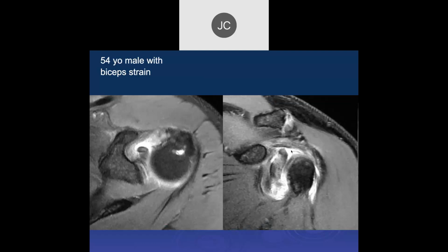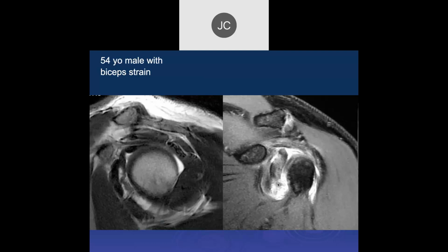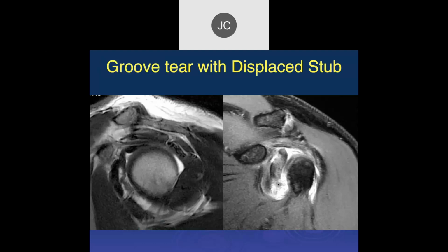That's the biceps tendon retracted down into the joint space. So this was even a bigger loose body. This is all the proximal stump of the biceps, and it can produce a major mass effect within the joint space, which can cause a lot of dysfunction and pain. It really acts like a loose body in the joint space. This is pretty rare. I've only seen a few of these. The ones I've seen, I think, are all in the lecture here.